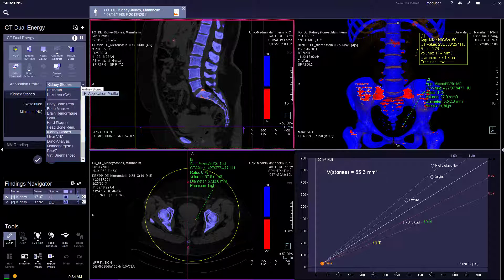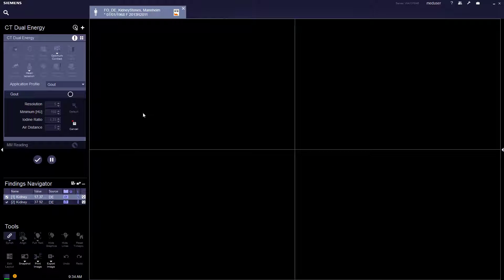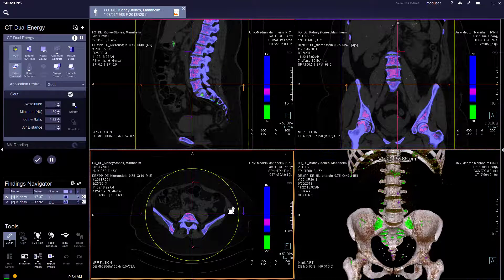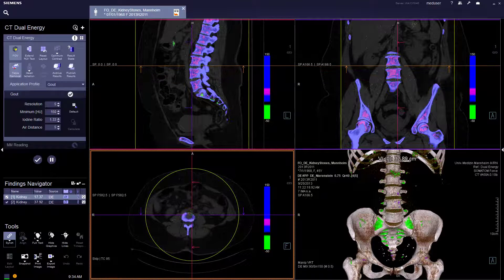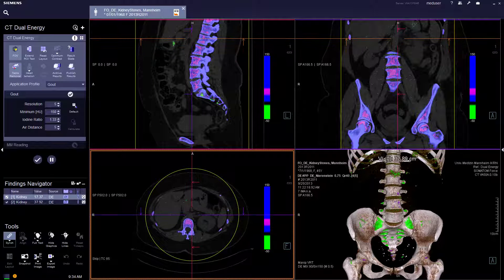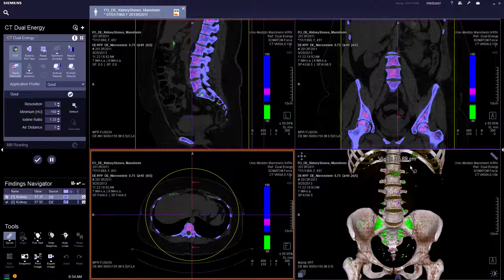Moving forward to gout. Change the application profile to gout. In dual energy gout processing, no marking is required. The system will automatically give a composition of all the gout crystals, which are all shown in green. This is based on the Hounsfield unit. And in the 3D view, the volume of all the gout crystals is given.